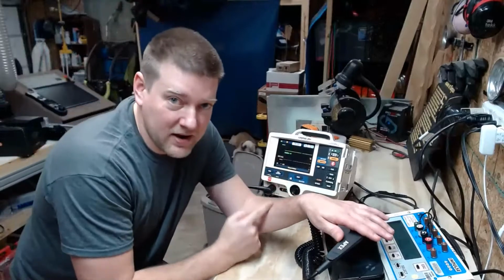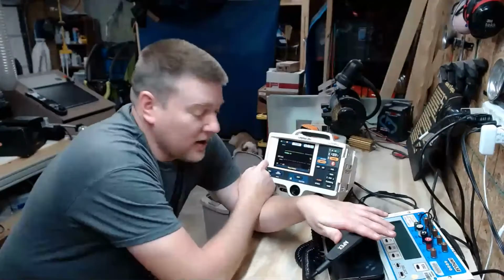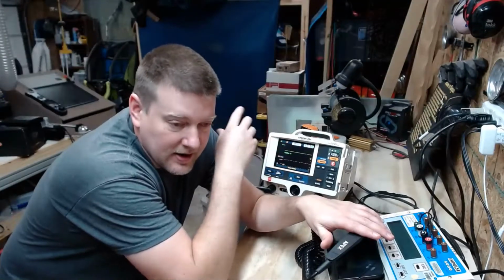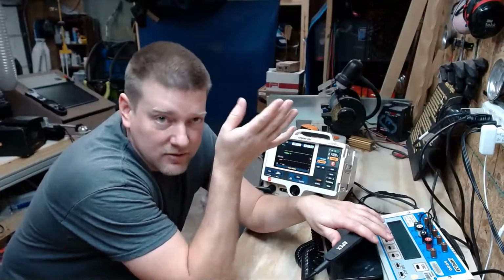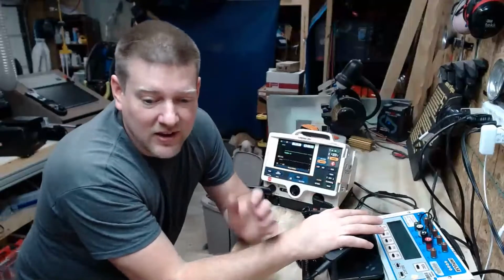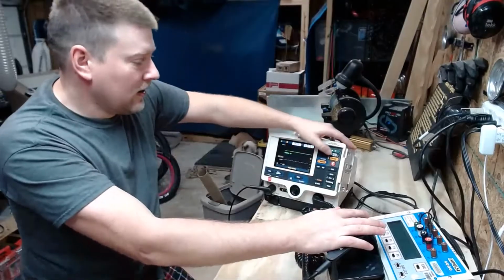I'm going to do it all on battery because I want to test out that battery to see how good it is. Now, the defibs, they know how old their battery is that's inserted. And after a certain date and time, it's going to give you an error code and you have to go and change out the battery. But we still don't know the health of the battery. So that's what we're testing by testing it all on battery.